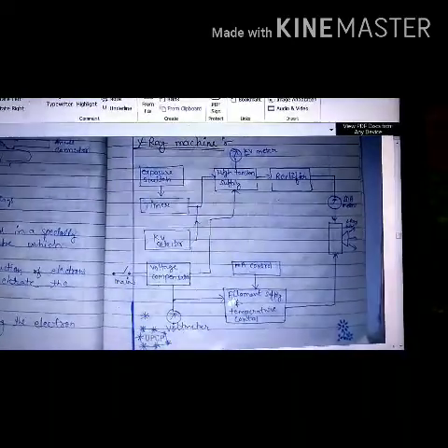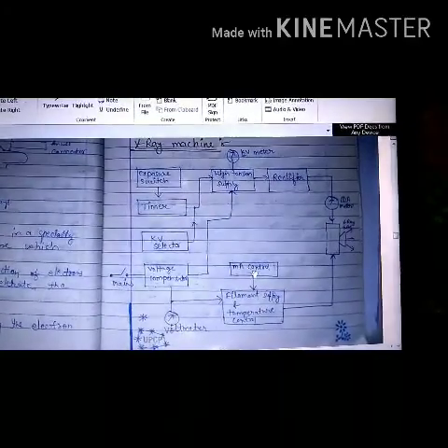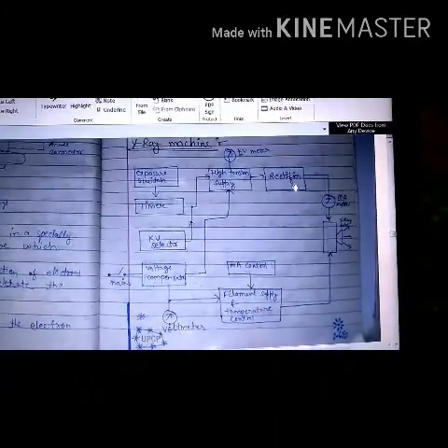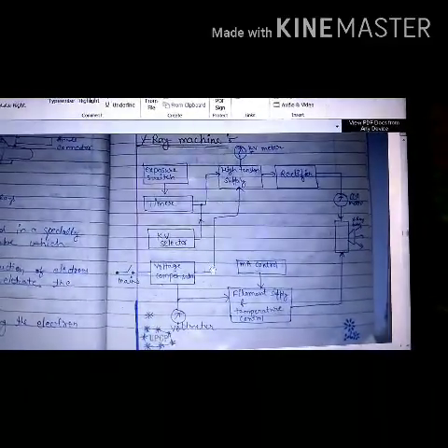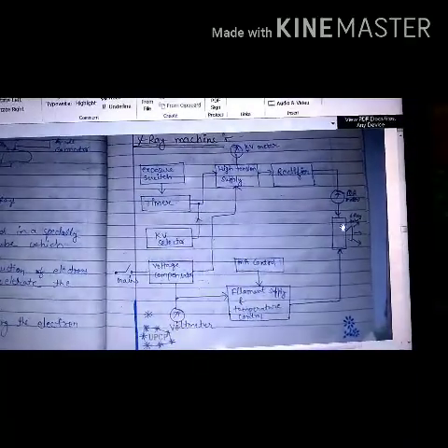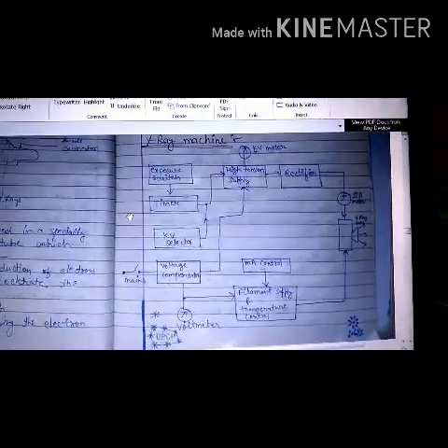Then there is a filament supply and temperature control switch with a milliampere control here. Then there is a high tension supply and a rectifier, which is rectifying the AC current which we are getting at our home to DC milliampere current. And this is the complete setup, where the X-ray tube is where the X-rays will be generated.